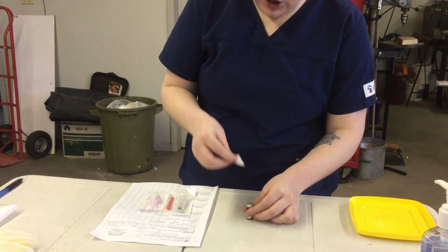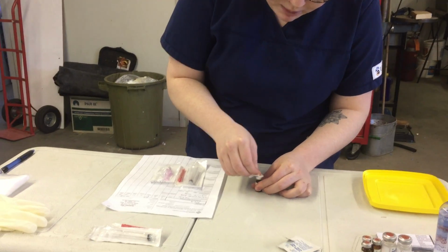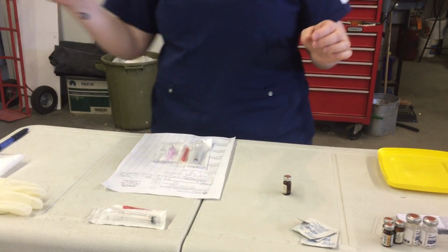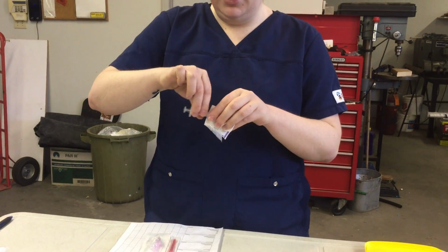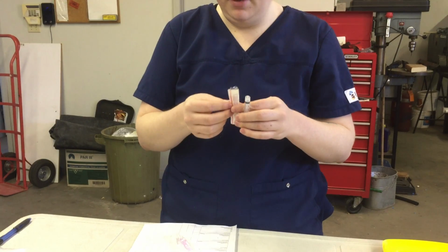And I'm going to clean the top of my vial here for 30 seconds in a circular motion. So for demo purposes, I'm going to say that was 30 seconds. And I'm going to let that dry, throw that in the garbage. So after I've done that, I'm just going to open my syringe here, making sure I'm not breaking sterility of the sterile aspects. I'm going to open my blunt fill needle.